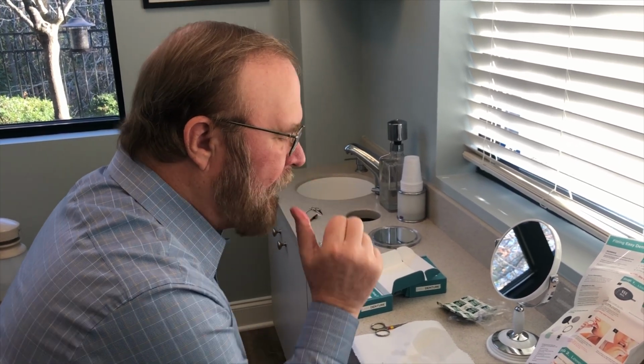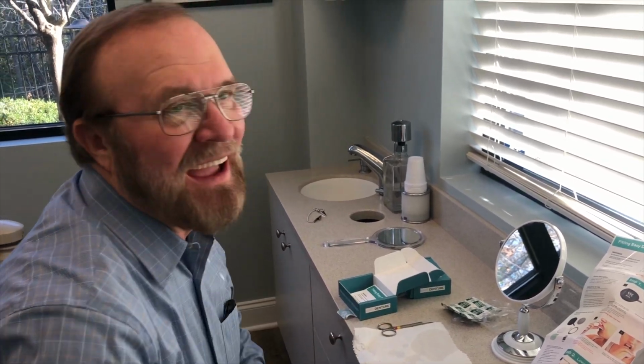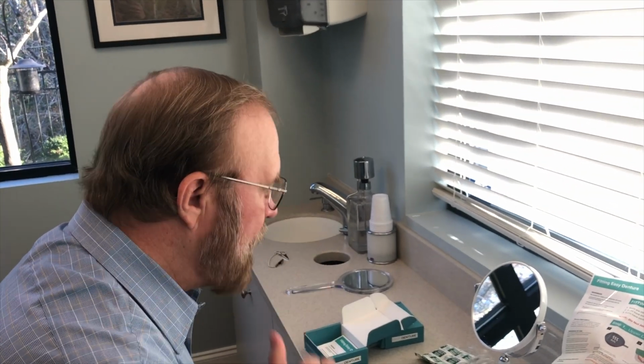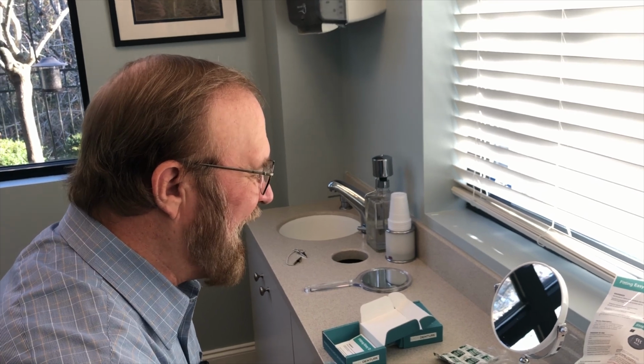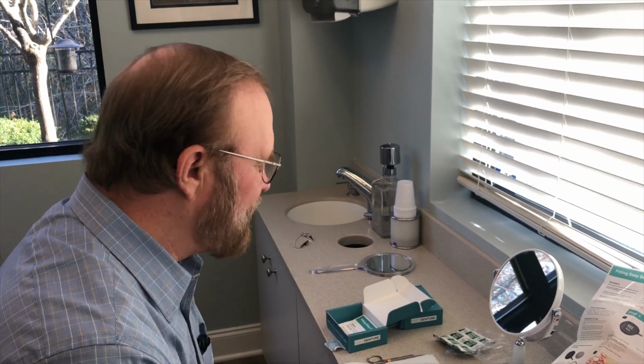And then it takes about a minute for it to set. That's pretty quick. You've got some teeth. That's a little easier than taking all those impressions and doing all those steps that we just did for your other denture, the one we're sending back to the lab. They look so good. Actually, they look better than those.